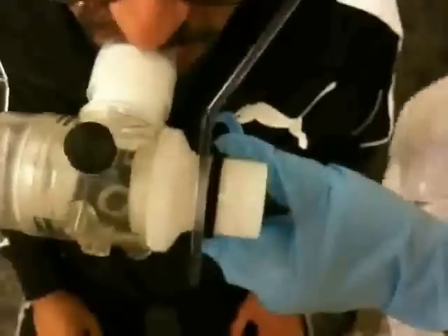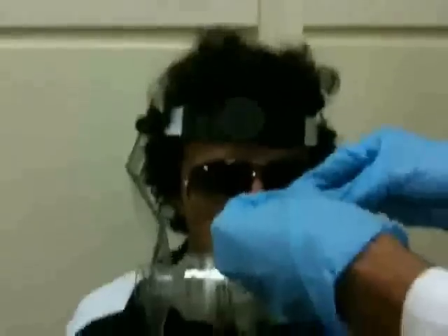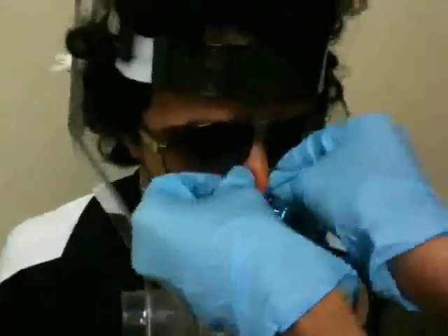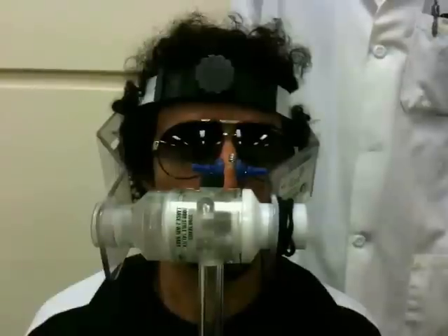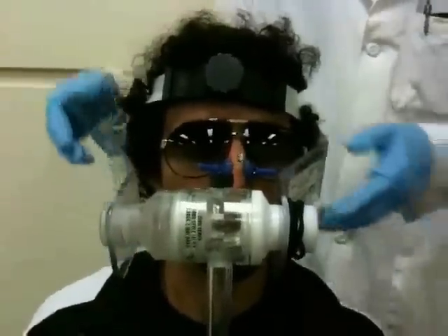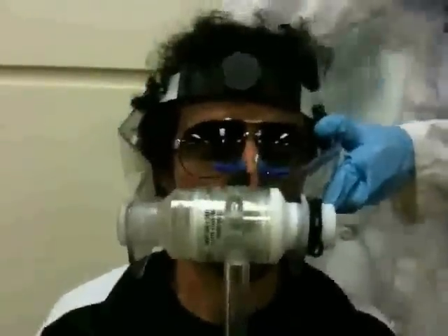Ensure proper tightness and do some last-minute checks. Nose piece. Everything is set. It's a tight fit.